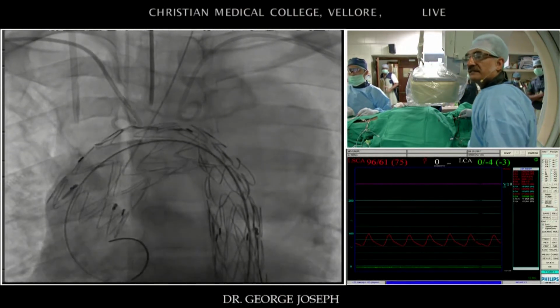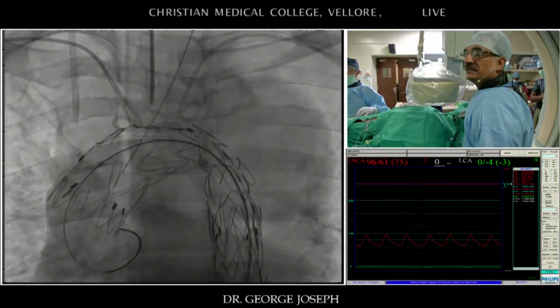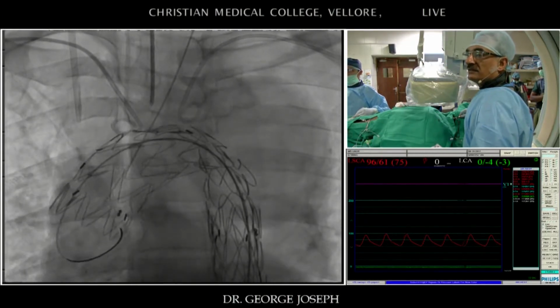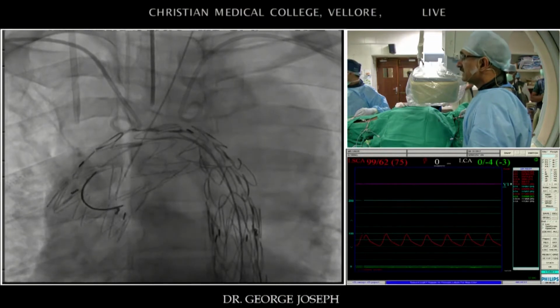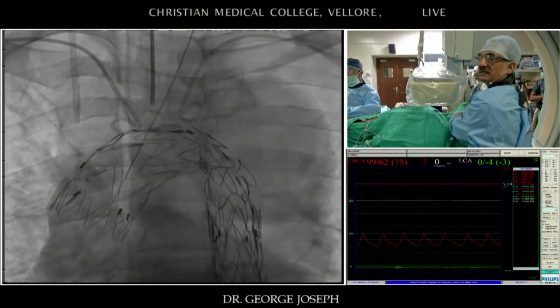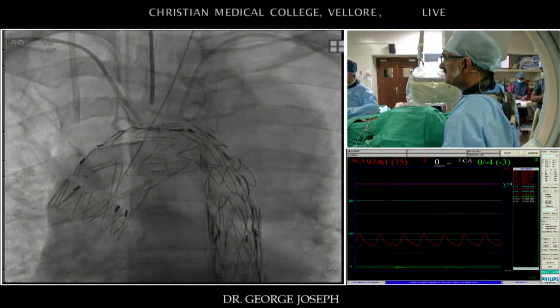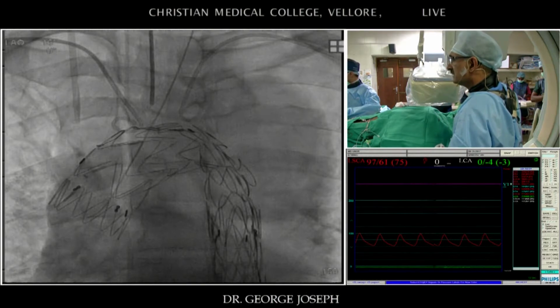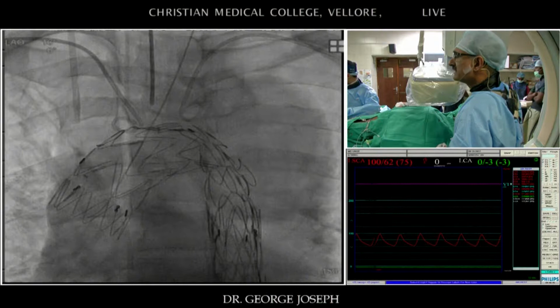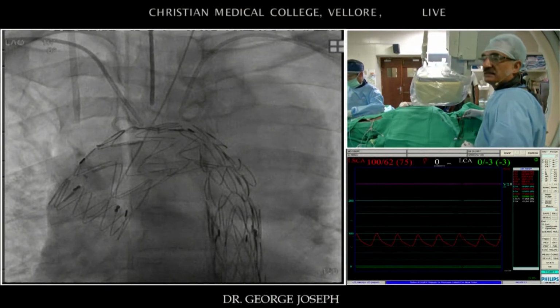So now Sujit's got his catheter up there. He's going to remove the Lundquist wire, take it out and bring the snare, please. Just bring the snare. You can use the blue tip, give the blue tip. No, from the other end. No, take that off, it's okay. Oh, okay, that's also a good way of doing it. Yeah, all right.